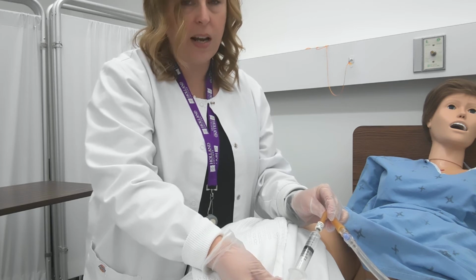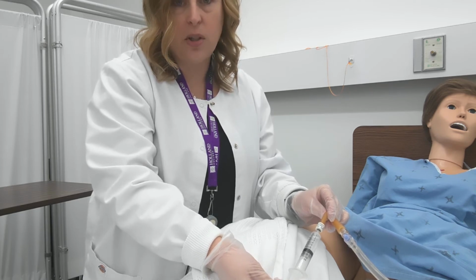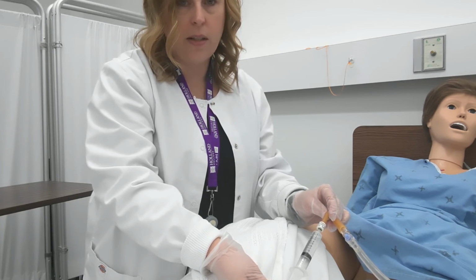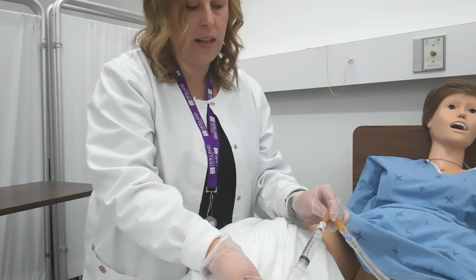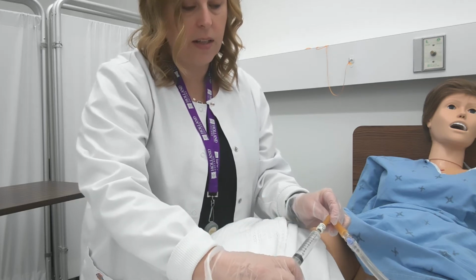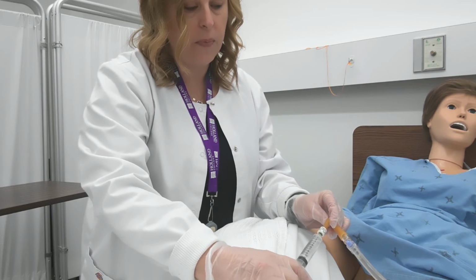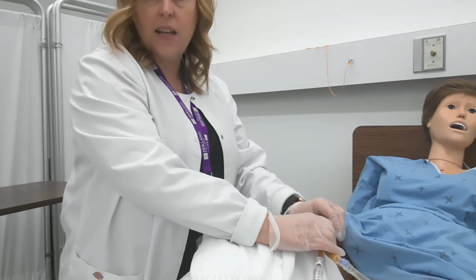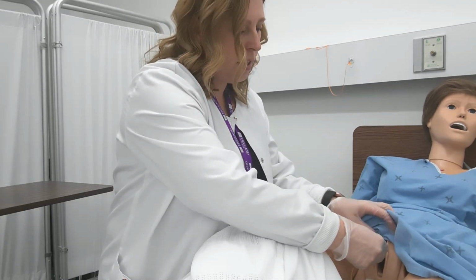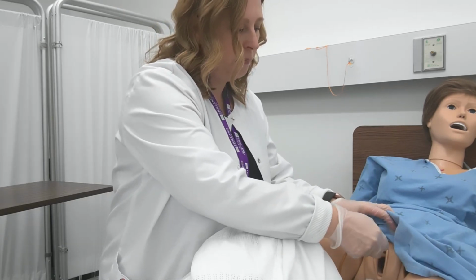I don't want to put any extra traction on here because I could damage the bulb and then make it very hard to remove. So I'm just going to let this go on its own till it gets to the end. Once it's completely deflated, I'll give it a little tug to make sure it's all come through. I'm going to instruct my patient to take a few deep breaths in and out, and while they're doing that, I'm going to gently remove that catheter.